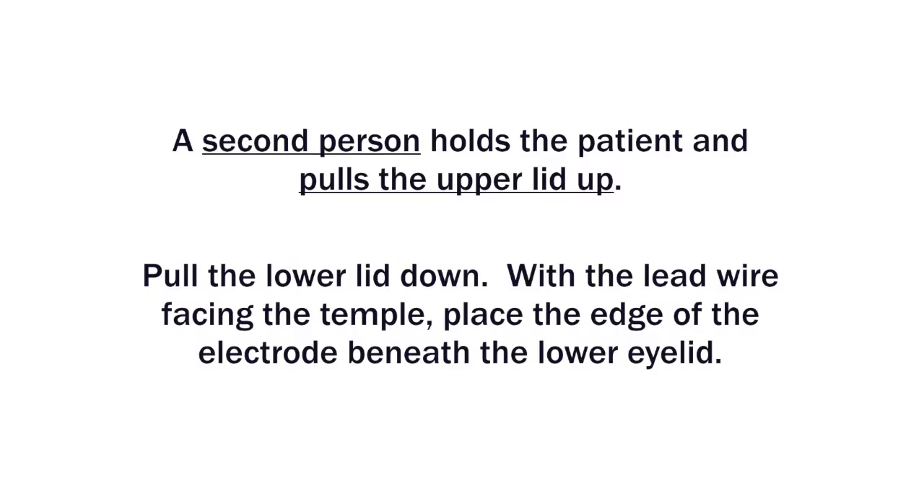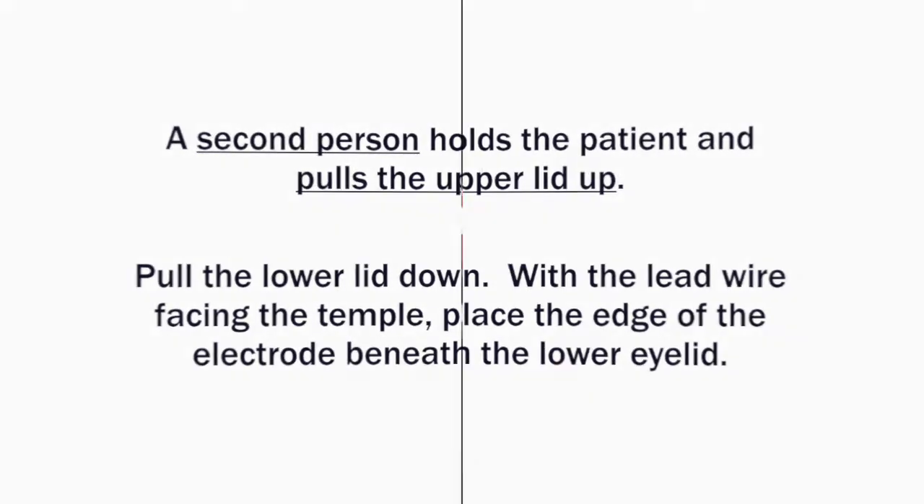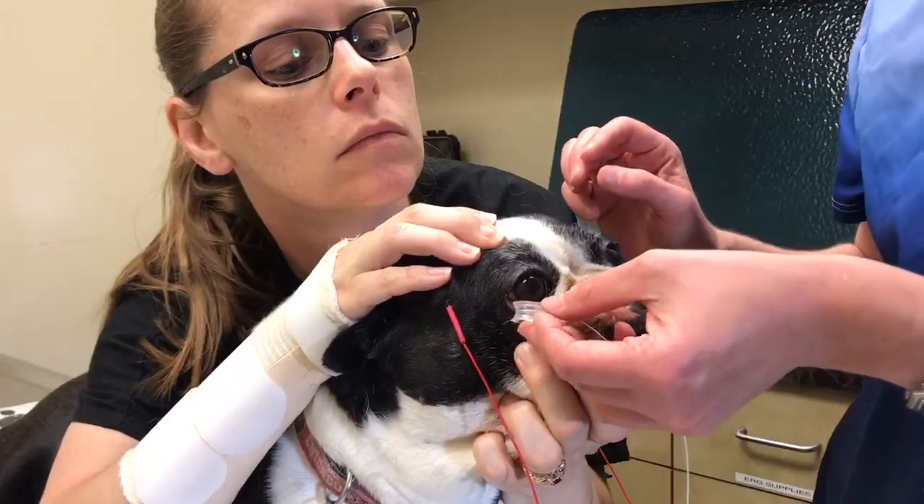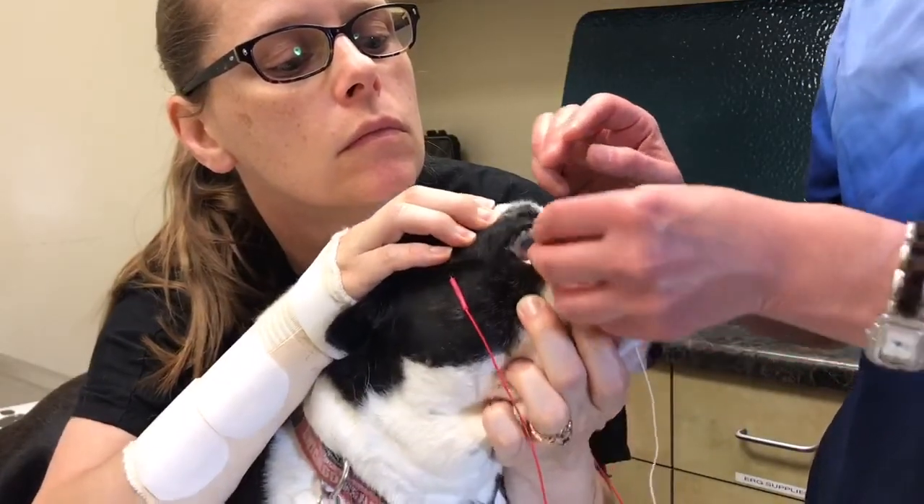While the second person holds the patient and pulls the upper lid up, pull the lower lid down, place the edge of the electrode beneath the lower eyelid, and tip the electrode into place. Release the upper and lower lid.